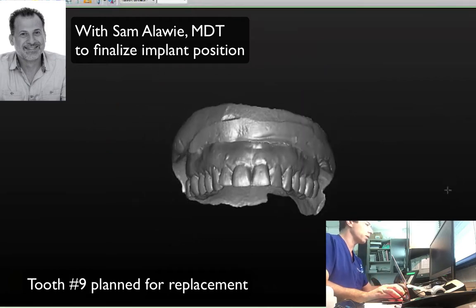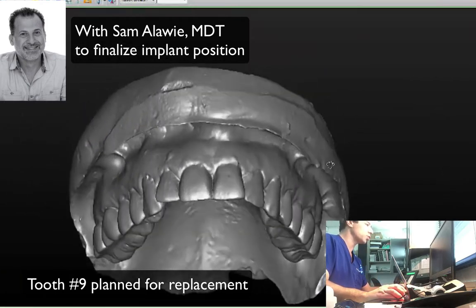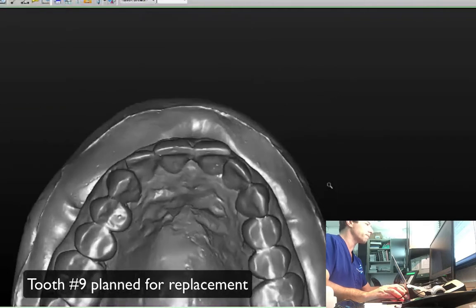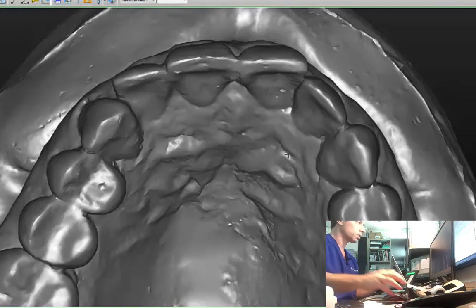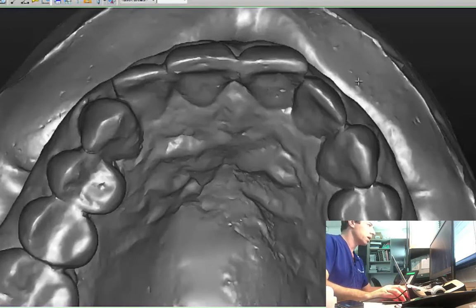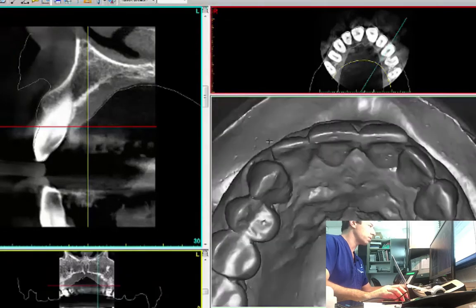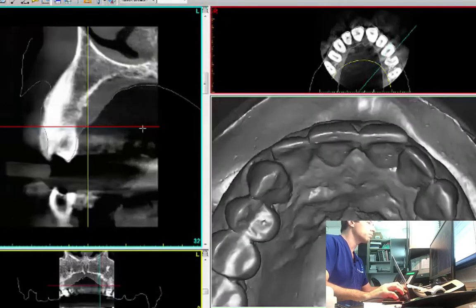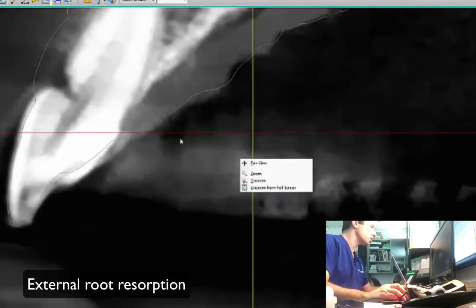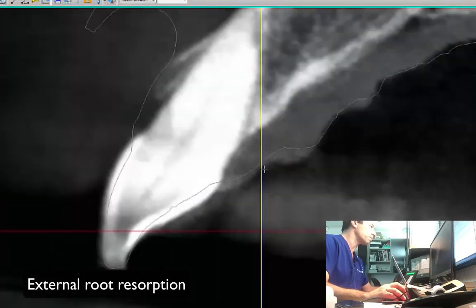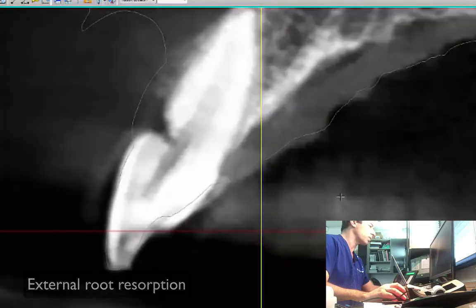So here's the model before the extraction. Tooth number nine is going to be replaced. You see the position of the tooth, the overlap. This tooth — tooth number nine — has a severe resorption. You can see this on the buccal. And it's already inside the nerve, right here. This is why we're replacing the tooth.